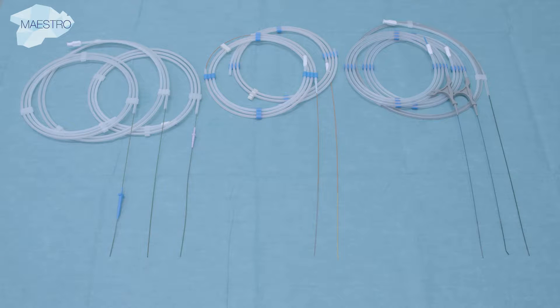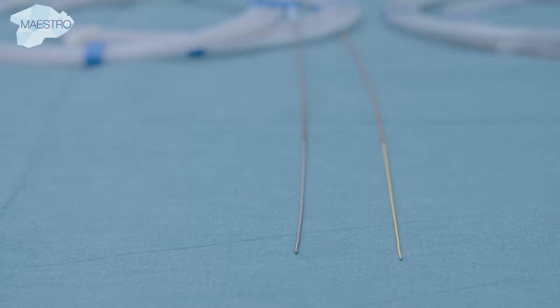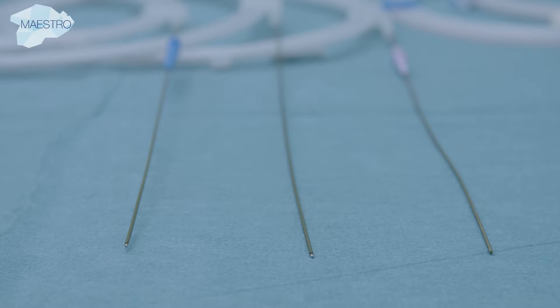Numerous types of wires have been developed and represent an indispensable tool for flexible ureteroscopic procedures. Wires with hydrophilic segments and a soft, floppy tip are recommended to facilitate easy access to the kidney. Two-in-one wires allow insertion of both tips into the patient, and featuring different tip stiffnesses allows disposable equipment to be spared.